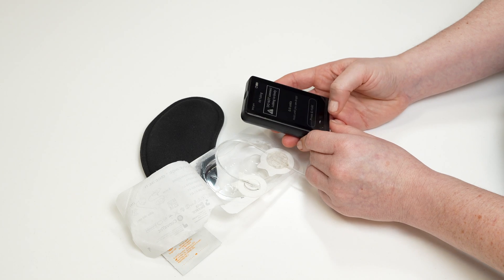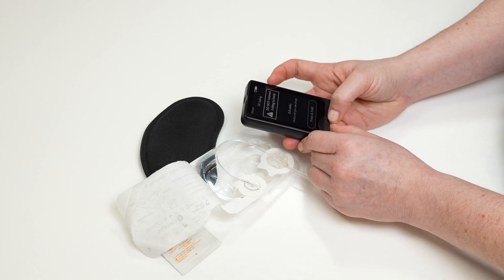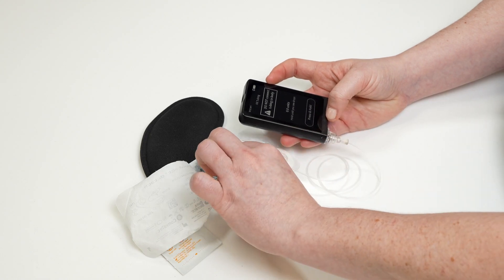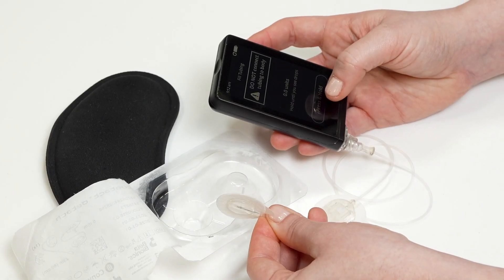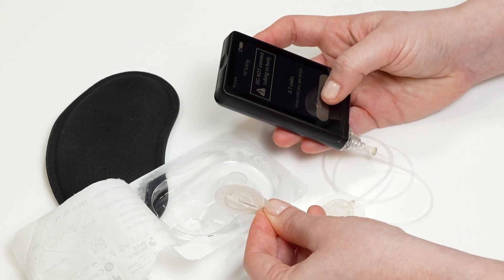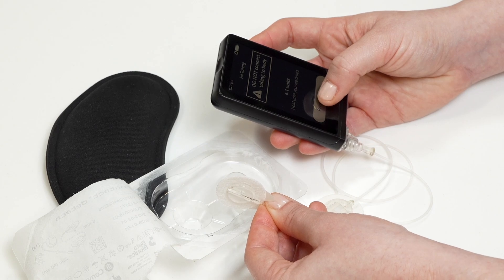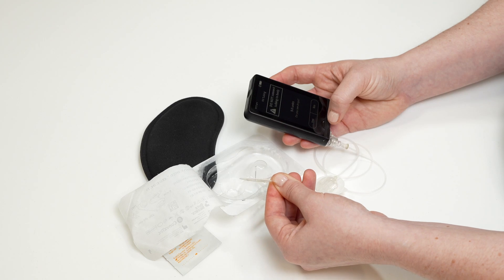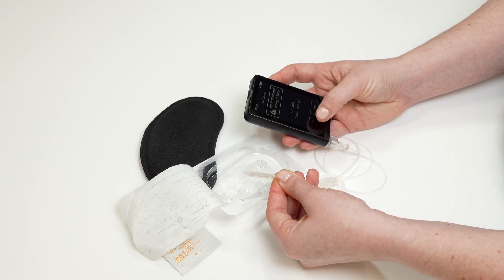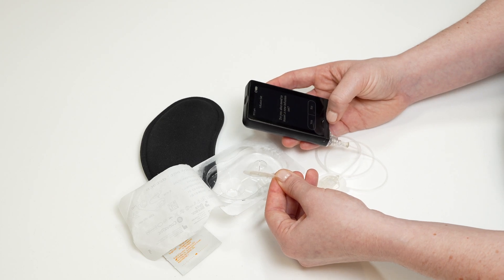Do not insert your infusion set yet. You must be disconnected from your infusion set before you fill the tubing. Tap and hold the press and hold button to begin filling your tubing with insulin. Hold the press and hold button until you see drops of insulin appear at the end of the tubing. Tap yes if you see drops at the end of the tubing. Tapping no will take you back to the press and hold screen so you can continue filling the tubing with insulin until you see drops.